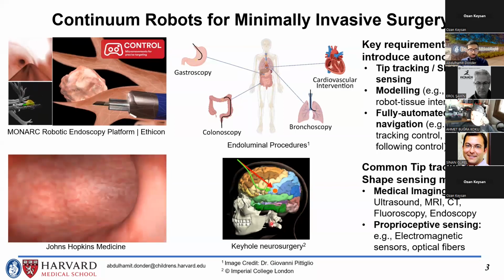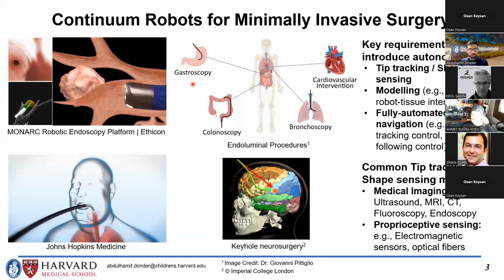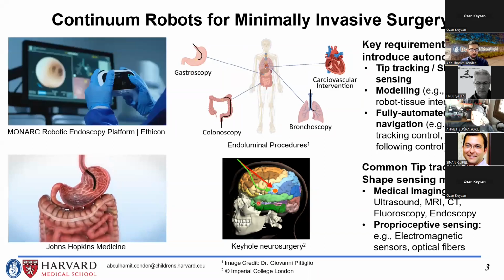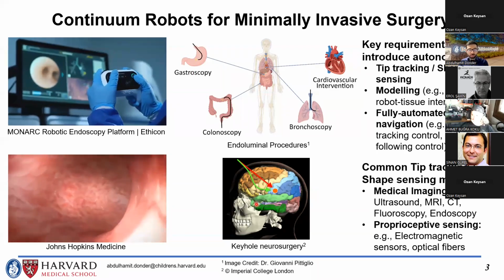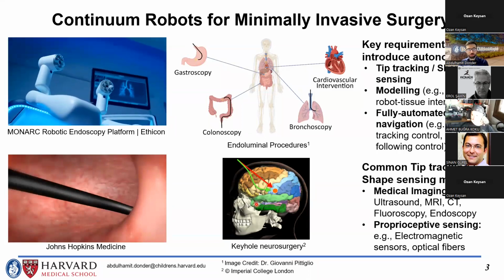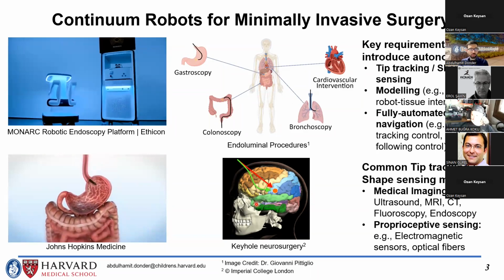And here the problem is a little bit different compared to these procedures where the catheter tip may move sideways as it is in the cavity. However, here, since it is surrounded by tissue, it needs to go forward to be able to steer just like a car or a fixed-wing plane in 3D.